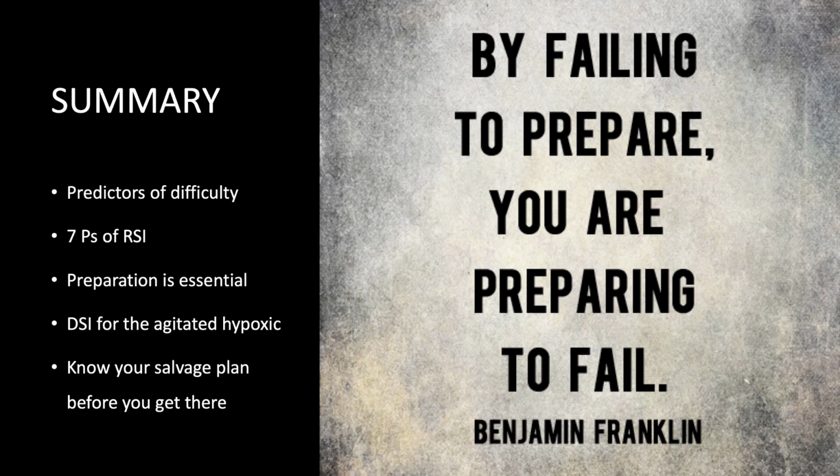Preparation is essential when managing an airway. It's essential when performing any procedure, and it's often the determinant of success or failure. So taking time to prepare your room, your equipment, and your team is going to pay dividends in terms of success when managing airways. We have delayed sequence intubation for the agitated hypoxic patient.